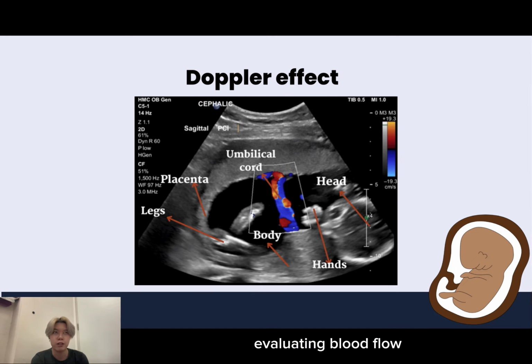The Doppler ultrasound uses frequency, or the rate at which the pitch changes, to measure blood flow velocity. Red blood cells in the blood vessels are an example of a moving item that alters the frequency of reflected ultrasonic waves. A positive Doppler shift, or frequency shift, results from an increase in the frequency of the reflected waves when the item is moving towards the ultrasonic transducer. A negative Doppler shift results from a drop in frequency when the item moves away from the transducer.